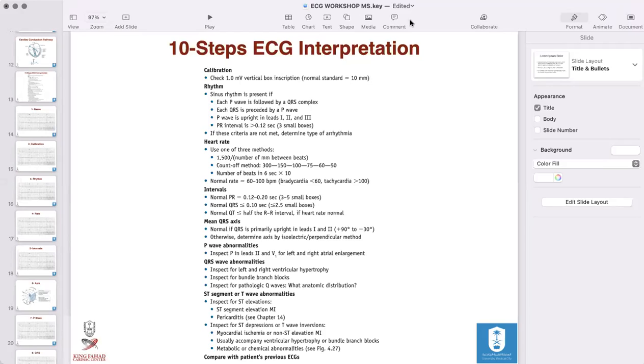I hope I answered your question. Yes, thank you, doctor. But if the patient came for the first time and was diagnosed with myocardial infarction with ST elevation, after the treatment, will the ECG come back to normal, or will it stay the same? And after that, if he comes again with chest pain, I compare it for normalization or more elevation, just to make it clear for me.